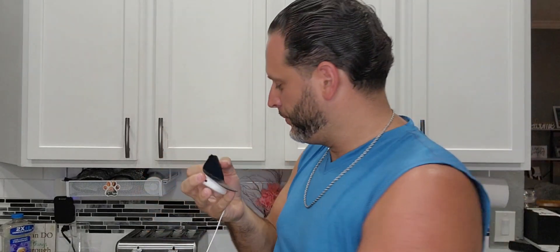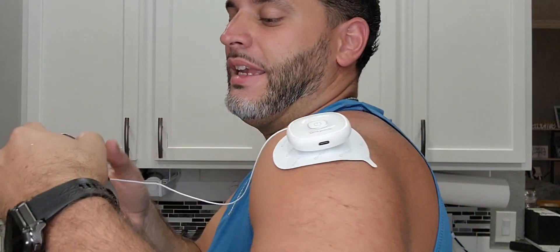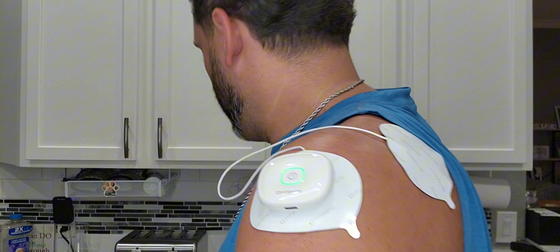Let's go ahead and place one of these on. Maybe you want to use it for your shoulder — you can go ahead and place one there, and one right behind the shoulder. This is the only wire, but technically it is wireless. It's got really good adhesive; it's easy to take off but also stays in place, which is nice.